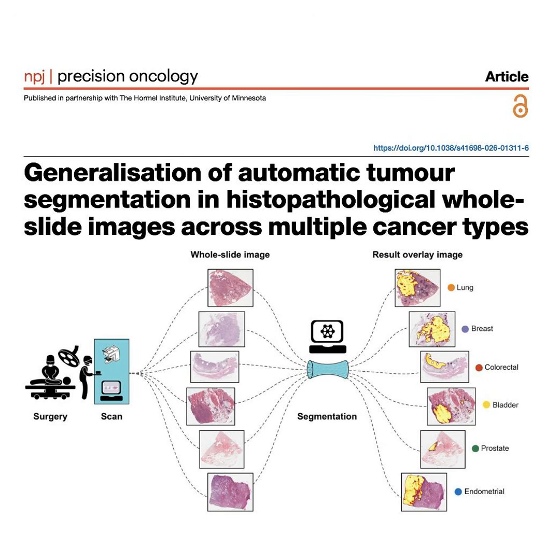Wait, a transurethral resection isn't a neat, clean slice of tissue like you'd get from a standard biopsy or a major organ removal. No, it is not. You're using a wire loop to basically scrape the tumor off the inside of the bladder wall. Exactly. So the samples in this data set were not solid, contiguous blocks of tissue. They were a fragmented, cauterized salad of tissue bits.